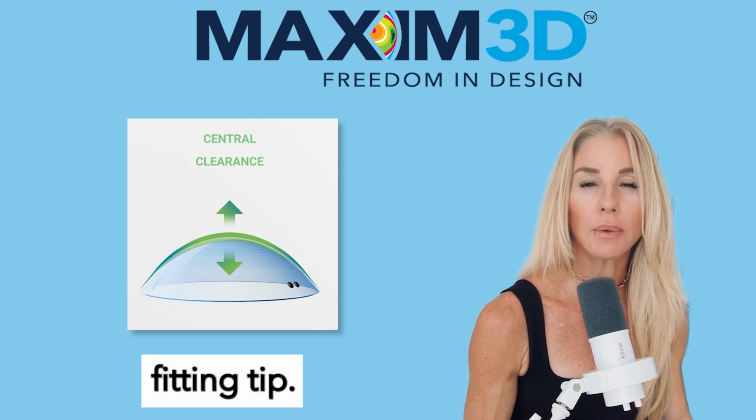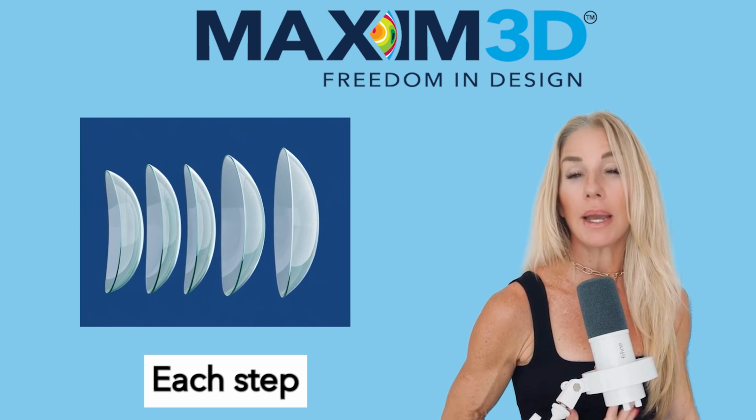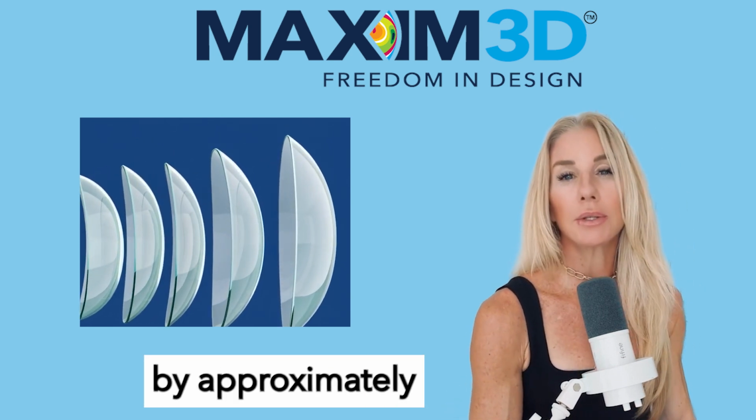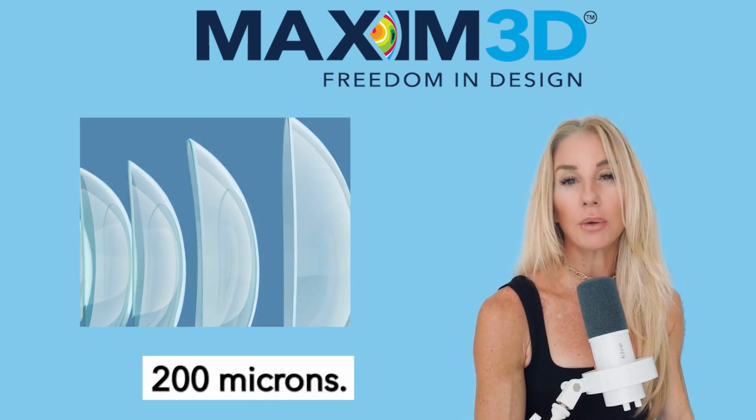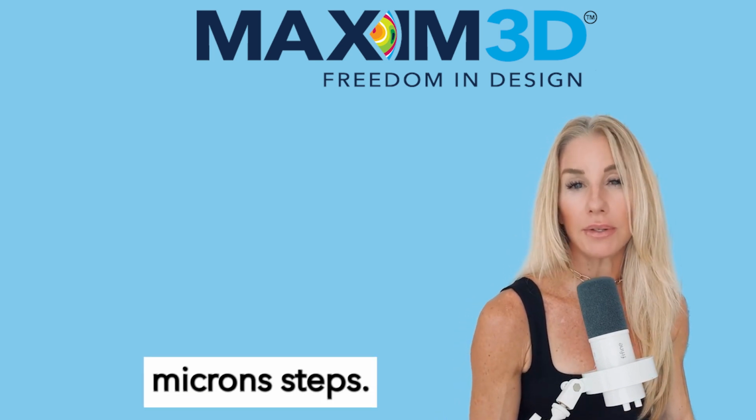Here is a fitting tip. If the clearance is off, move to the next lens in the fitting set. Each step increases sagittal depth by approximately 150 to 200 microns. For more nuanced changes, modify in 25 to 50 micron steps.